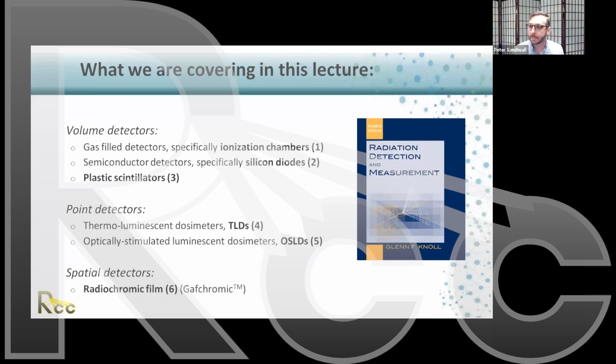It's like Q-tips. You can create radiochromic films that are different than GafChromic, but GafChromic is the most well-known brand, and that name is kind of synonymous with radiochromic.